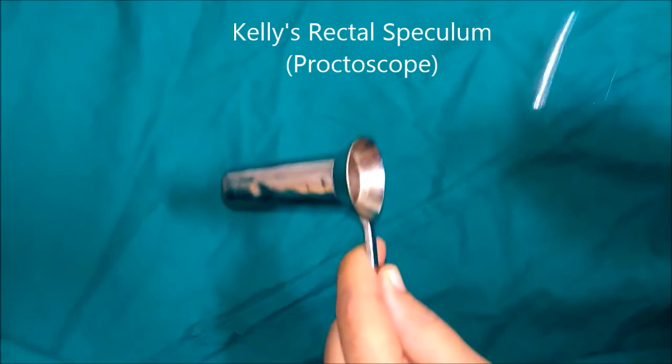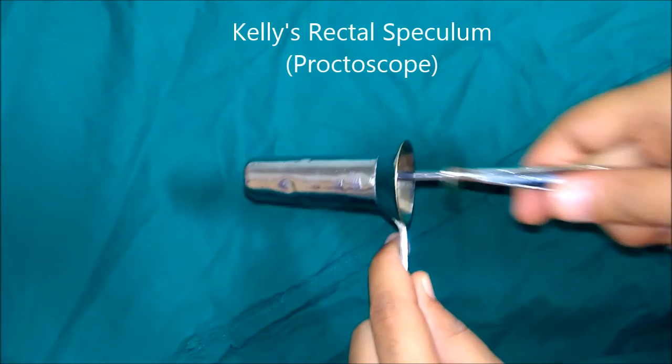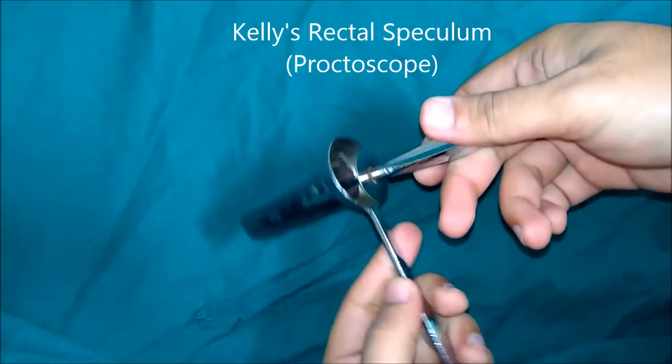This is Kelly's rectal speculum, commonly known as a proctoscope. There is an outer hollow sheath with a handle called the scope, and an inner rod called the obturator whose terminal part is smooth and rounded to avoid trauma. Its diagnostic uses include diagnosis of piles, anal or rectal polyp, carcinoma of the anal canal or rectum, ulcerative colitis, or finding the internal opening of a perianal fistula. For therapeutic use, it can be used for injection of piles or during polypectomy.